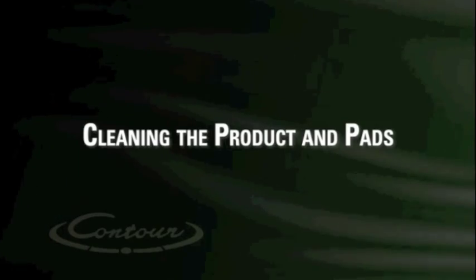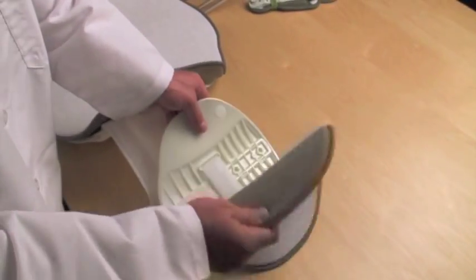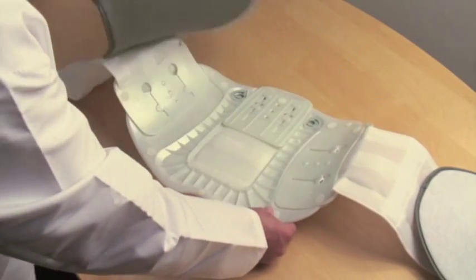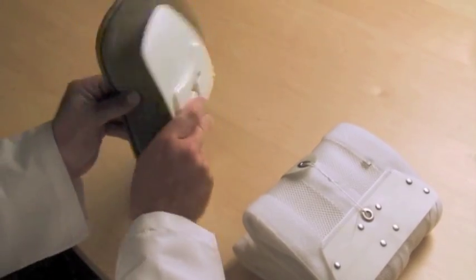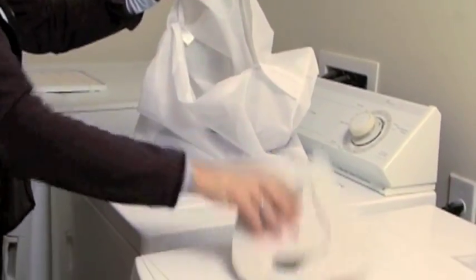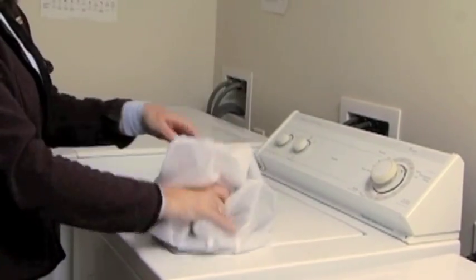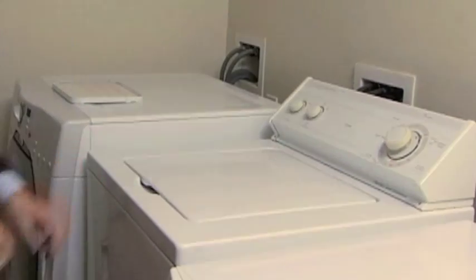Cleaning the product and pads. All of the products in the Contour system have removable pads which can be washed. When cleaning the Quickdraw and/or pads, use mild soap and water and let air dry. If using a washing machine, we suggest using a garment bag to avoid entanglement and fraying.